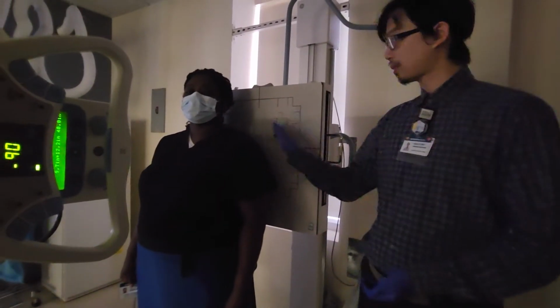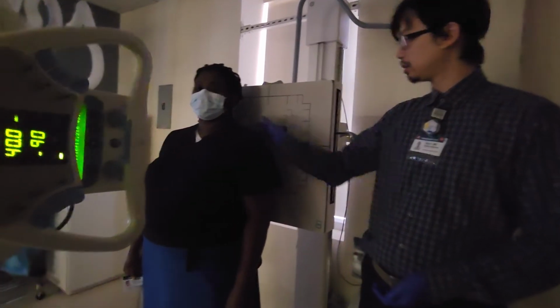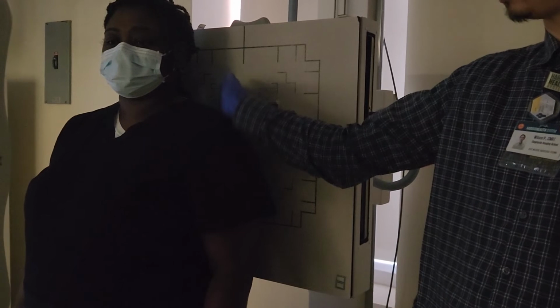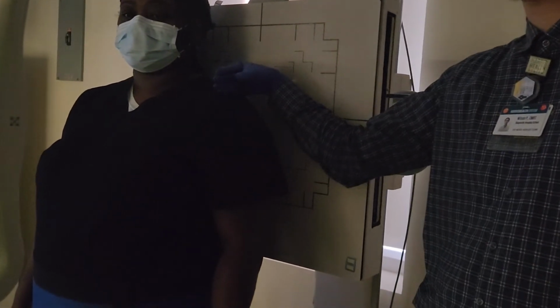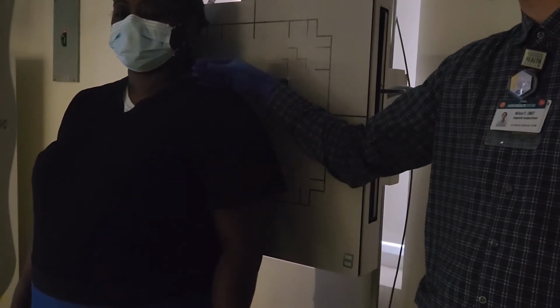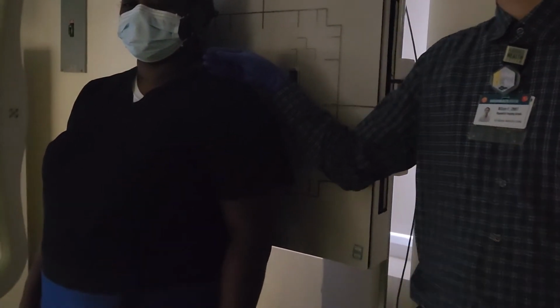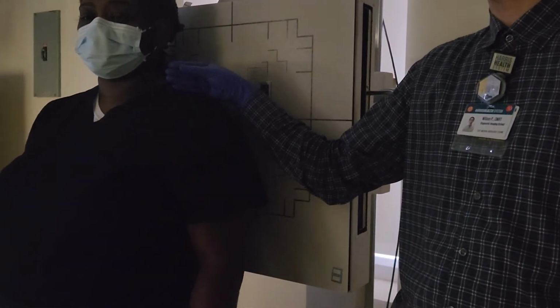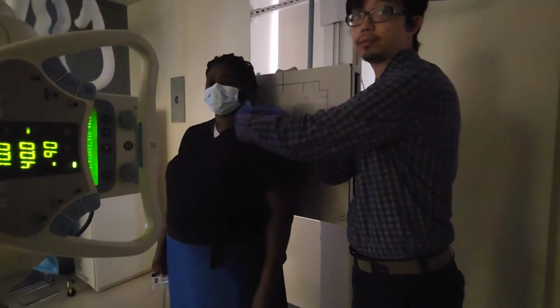Now, if you take a look at our patient right now, the scapula is not parallel to the IR. The scapula is actually angled like this. The joint space is not parallel to the IR. The joint space is angled like this. That's the scapulohumeral joint. The Grashey method is here to open up this joint space. So we need to be able to put this joint space parallel to the central ray.